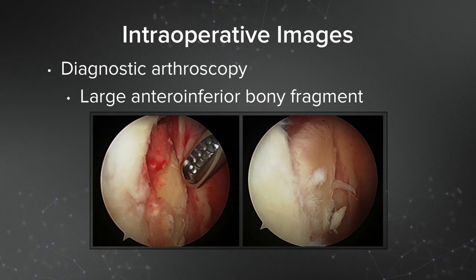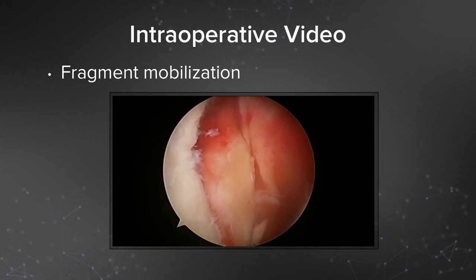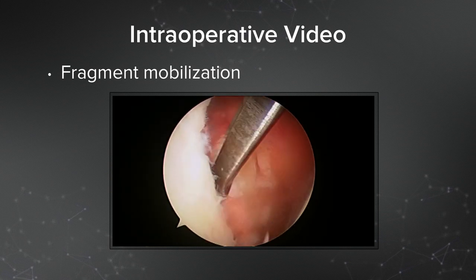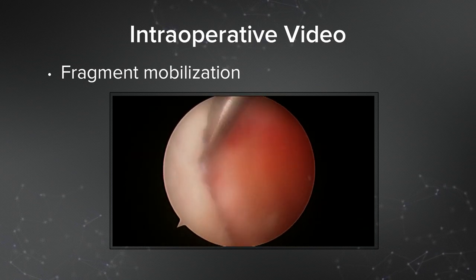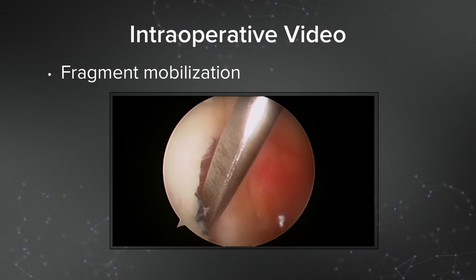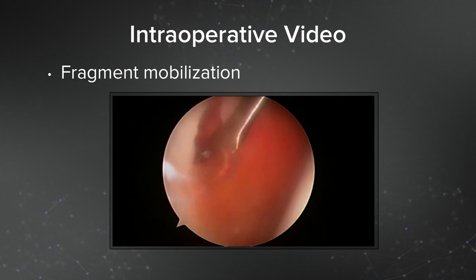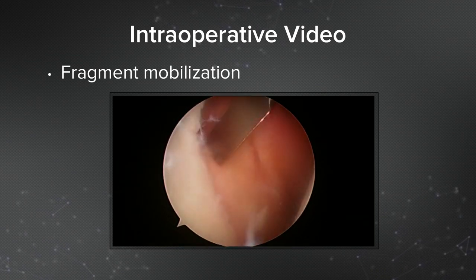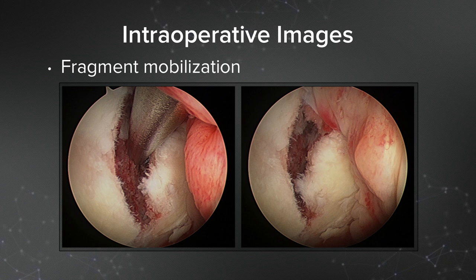Here are some intraoperative images. This is the diagnostic arthroscopy portion of the case, and you can see the large anterior-inferior bony fragment. Here is video of mobilizing the fracture — I placed a liberator elevator between the fracture site. You want to mobilize that fracture and make sure it's completely loose. If it's partially attached, detach it so you can get an anatomic reduction. Don't be fearful of fracturing it further — make sure there's good separation. I'm looking down the high anterior lateral portal right into the fracture site with a shaver to remove all clot, debris, and any comminution, so it's a totally free fragment.